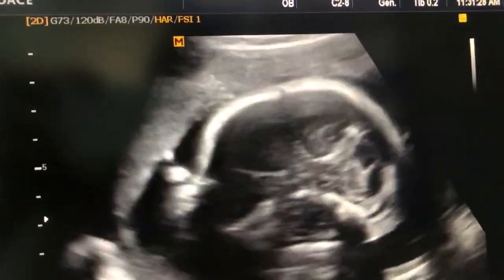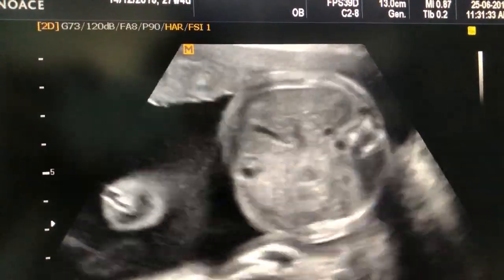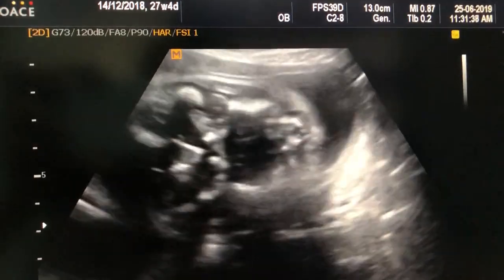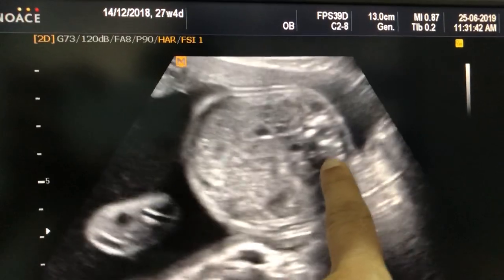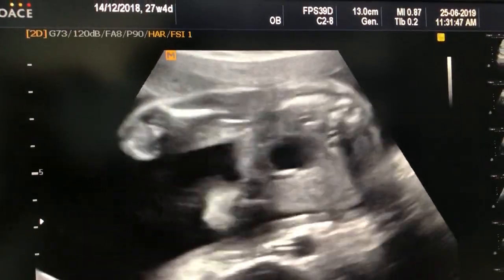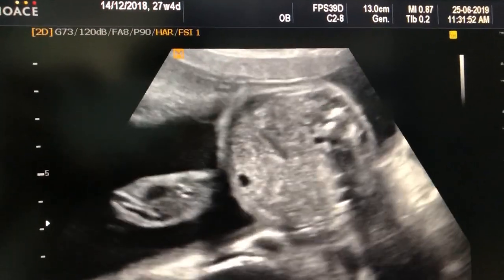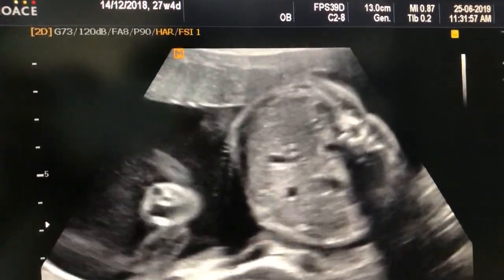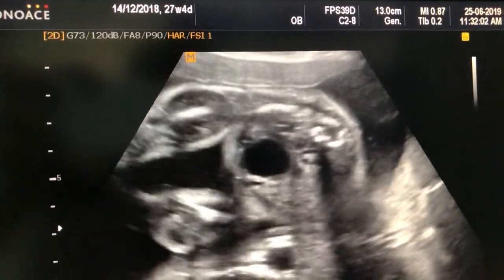Rest of the anomalies are not seen. Sorry, there are no positive findings in rest of the areas. And here in transverse view you see three dots, but in lumbosacral region you will see something is missing. Some of the elements they are missing in spina bifida. You have to trace this whole spinal canal in transverse view also.